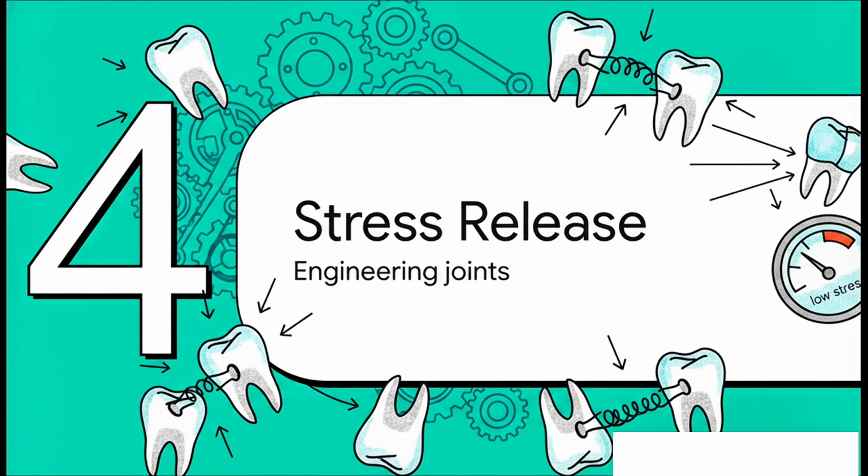Which leads us perfectly into Section 4, engineering stress release. Speaking of managing loads, we've got to create flexible joints, so our remaining abutment teeth aren't just completely wrenched out of place every time the patient chews.